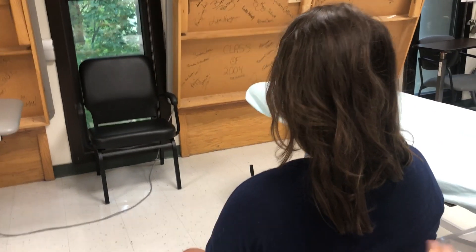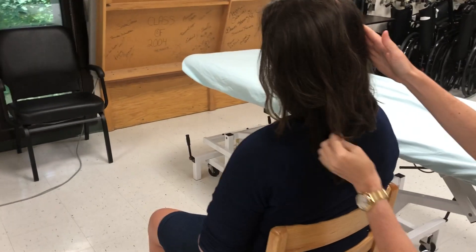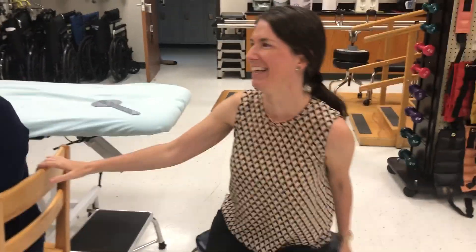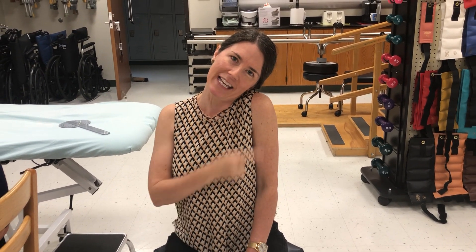A common compensation: if someone is limited in side flexion to the left, you might see ipsilateral shoulder elevation — bringing the shoulder to the ear instead of the ear to the shoulder. You would say: don't bring your shoulder up, make sure you bring your ear down. You could also give a tactile cue there. The other compensation would be ipsilateral side bending of the trunk. Again, you'd give verbal cues, and if that wasn't working, you'd give a tactile cue on the lateral shoulder to keep them upright.